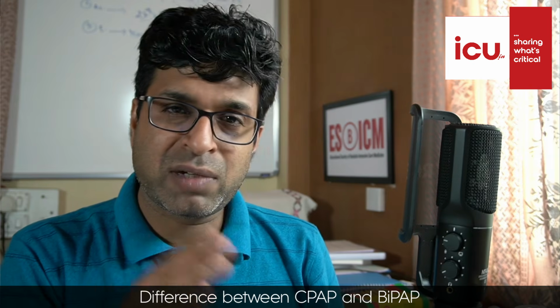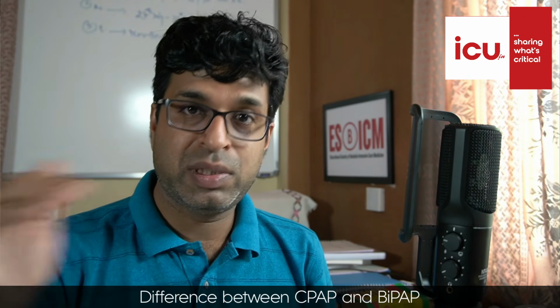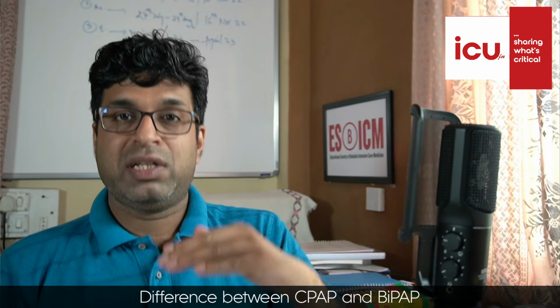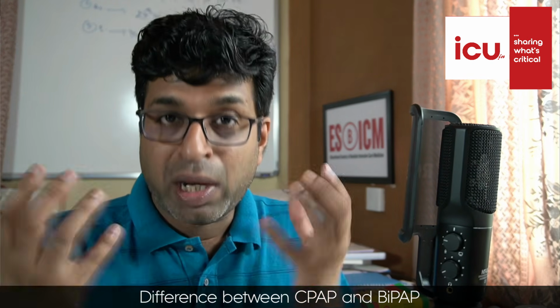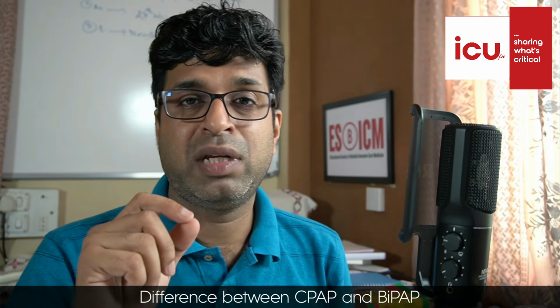Now, if there is a second blood gas in which the PO2 is normal, somewhere around 80-90, but your PCO2 is 50-52 and pH is 7.2, it is respiratory acidosis. You want the chest to expand and collapse, so that you ventilate properly. So you will increase the IPAP, you will increase the difference between IPAP and EPAP. We'll increase the IPAP to a higher level, so the difference between EPAP and IPAP increases, and now the chest can expand and collapse in a more comfortable manner. So that's the difference between EPAP and IPAP.